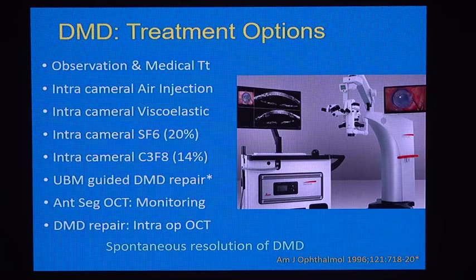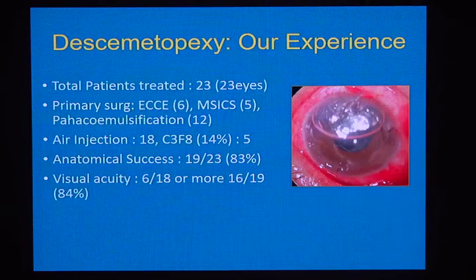UBM guided repair is possible, and anterior segment monitoring with intraoperative OCT is a very useful tool. This is our experience. We have done 23 cases and air injection in most of the cases, and we got very good anatomical success.